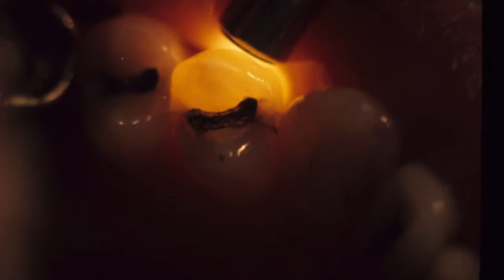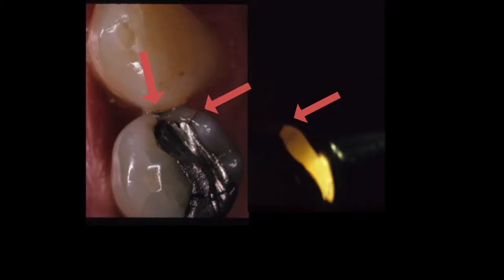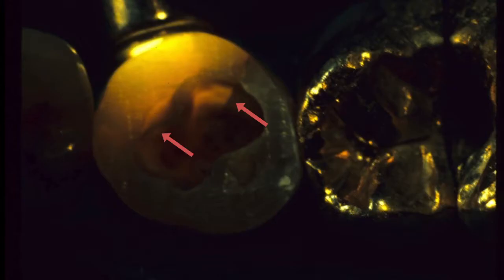Here we see the dilemma that we face every day. There are cracks over the marginal ridge, both mesially and distally. The distal one transmits just fine, but the mesial one is suspicious. This one requires very careful reevaluation at every subsequent appointment, using various angles and light intensity. Here, lighting from the buccal as well as the lingual is required. Once the pulpal floor has been exposed by preparation, it's then easy to evaluate the extent of the cracks.